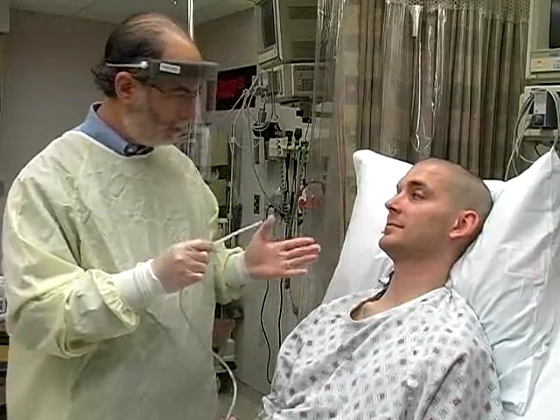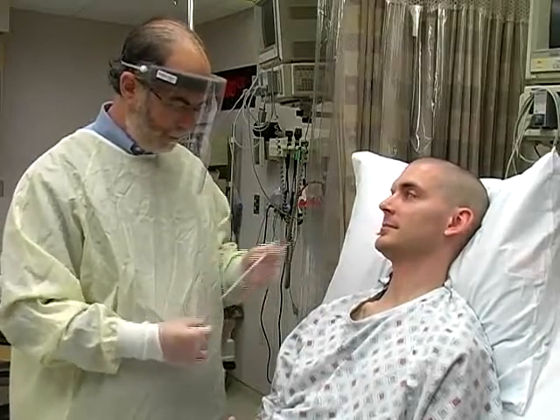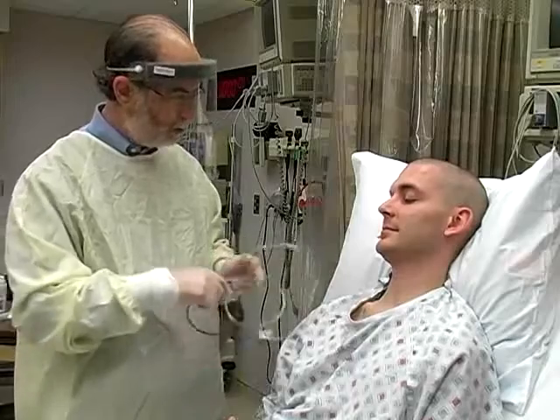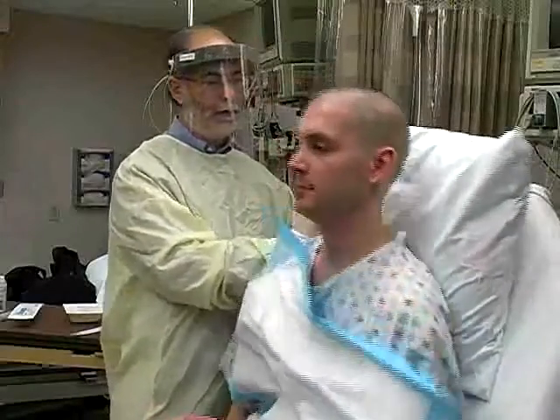Before beginning, explain the procedure to the patient. Inform him that you will provide topical anesthesia to reduce discomfort and that you will need his cooperation in swallowing while the tube is being advanced. Place an absorbent pad across the patient's chest and provide him with an emesis basin.